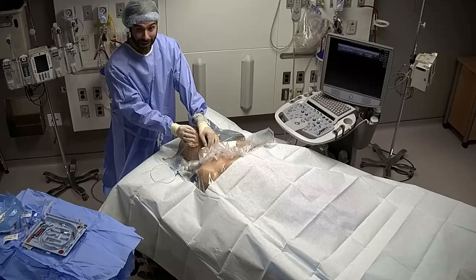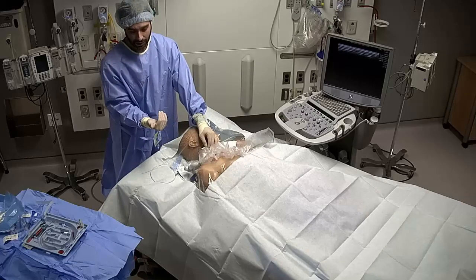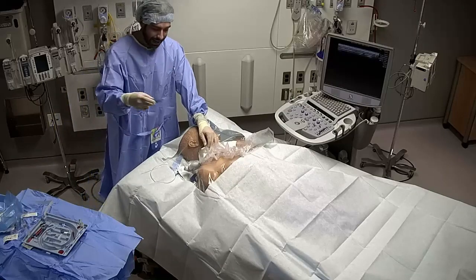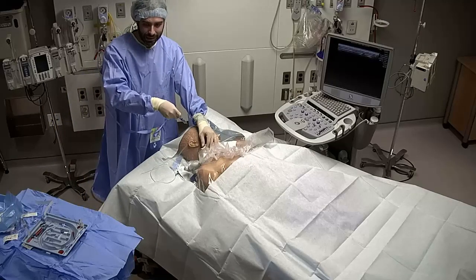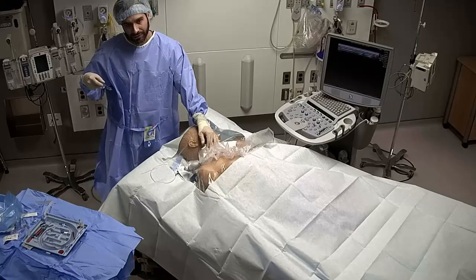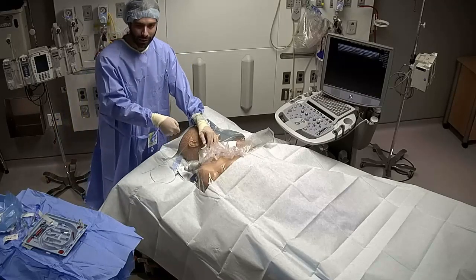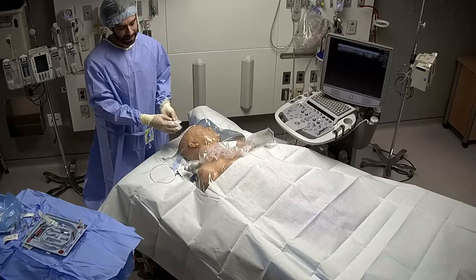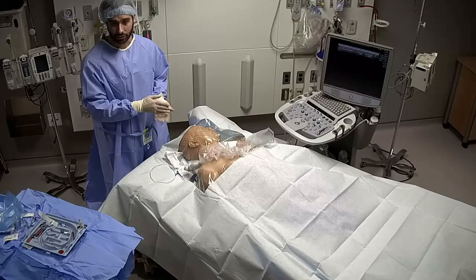So just pull the needle back slowly, and you'll start to see venous return flow. Or you can actually put the syringe back on top and aspirate as you pull back out slowly, and you usually have gone through the vessel. And when you traverse back out, you'll go back through the vessel on your way out. And then you can place the guide wire back in. So now at this point, we assume that we have the wire inside the internal jugular vein.